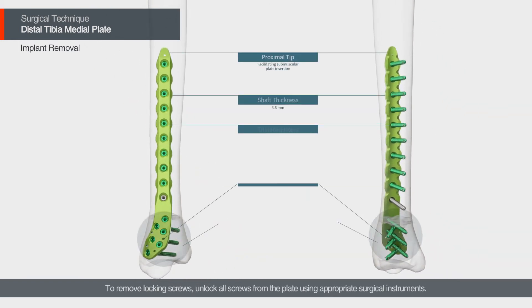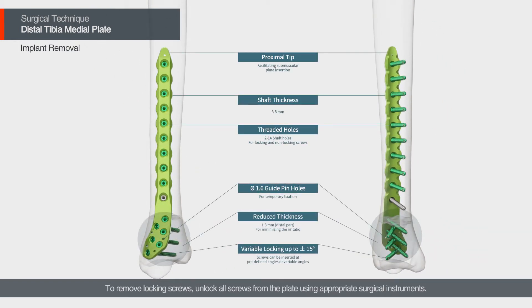To remove locking screws, unlock all screws from the plate using appropriate surgical instruments.